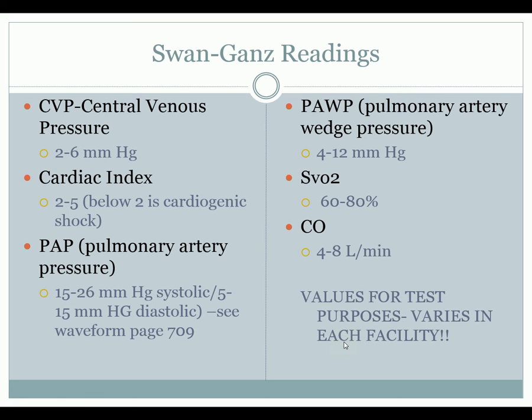So what do these pressures mean? Let's go back up here and look at central venous pressure, which was also called what? RAP, the right atrial pressure, same thing. If it is increased, let's say you go in and the reading's at 8, then you've got increased pressure. So you've got increased right ventricular pressure. A lot of times that means an enlargement of the right ventricle.